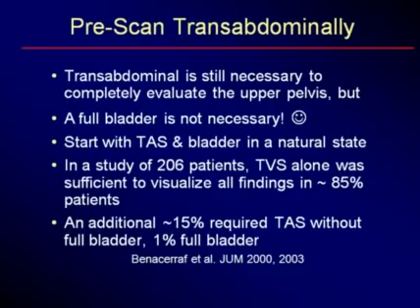So if a patient comes with an empty bladder and happens to be in this very low percentage that she would need a full bladder, we will then have her drink and fill her bladder. This may happen, for example, in a very young girl, a virginal patient, or a very old patient who cannot tolerate a transvaginal exam. But that will only be a very small percentage of patients that have to sit and wait and fill their bladders.